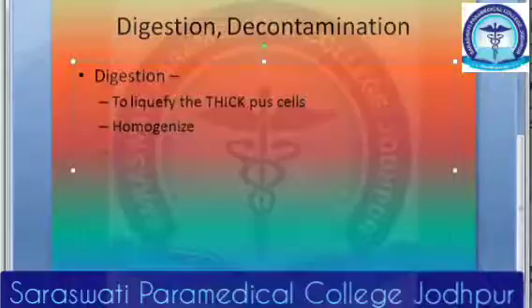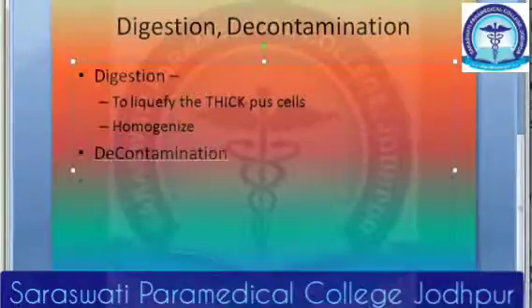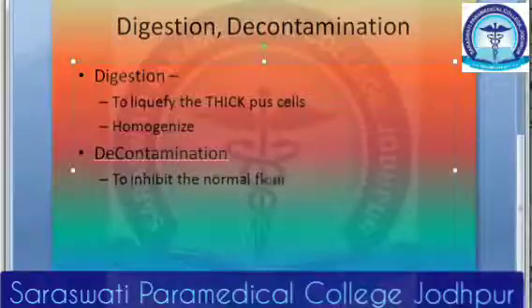Now you want to decontaminate it. Decontamination is to inhibit the normal flora. Basically, there will be so many types of things, especially in sputum.